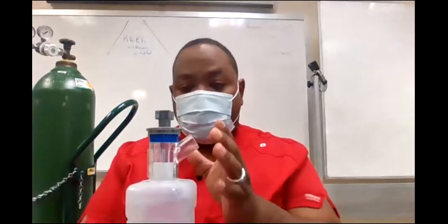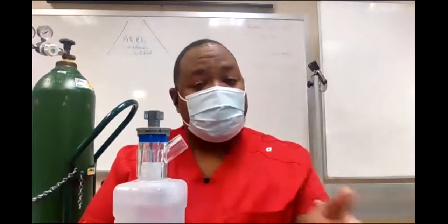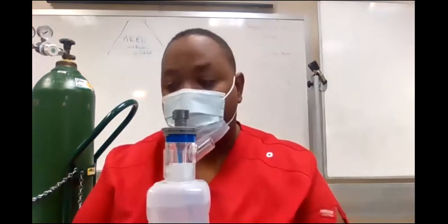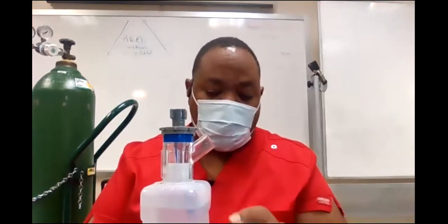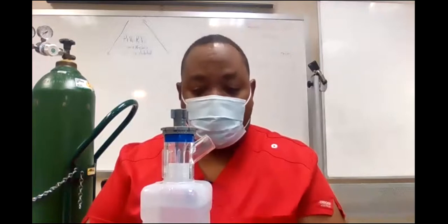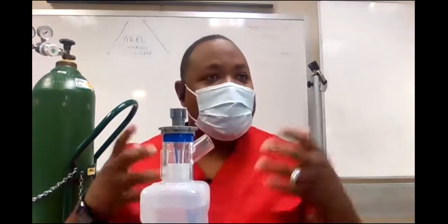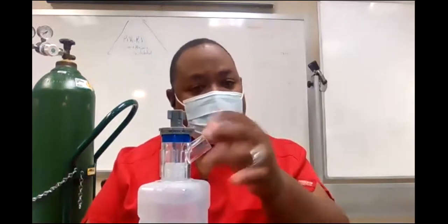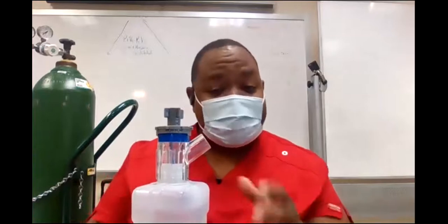So there's another principle that's involved with this Venturi principle when you're dealing with water, and that's the Bernoulli Principle, which talks about the water going through a tube. The water will go up through the tube and create a mist. So not only are they getting that good flow and oxygen, but they're also going to get some mist coming out of there. Basically because a lot of times we use this for our artificial airway patients.